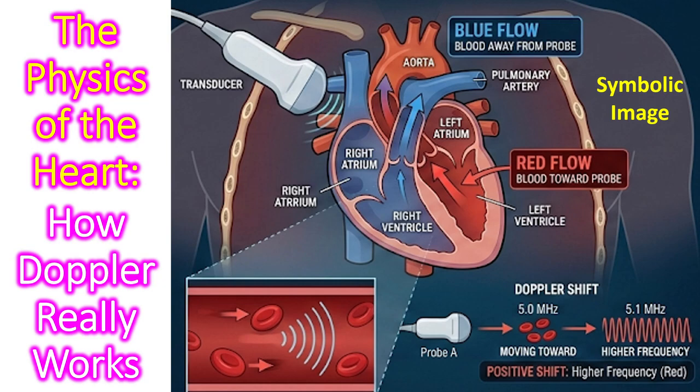In clinical cardiology, Doppler ultrasonography is the application of the Doppler effect, a shift in the frequency of a wave relative to an observer moving compared to the source. In the heart, the moving objects are red blood cells, erythrocytes. Understanding how this translates from a pitch change to a color map or a spectral waveform requires looking at the interplay of fluid dynamics and wave physics.